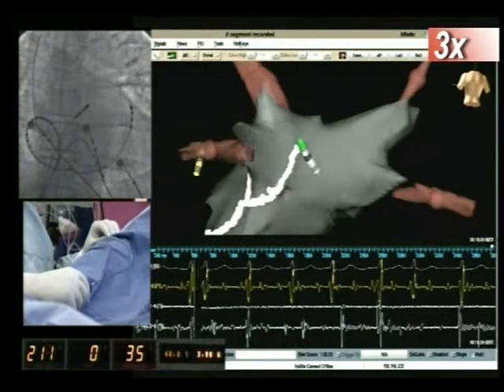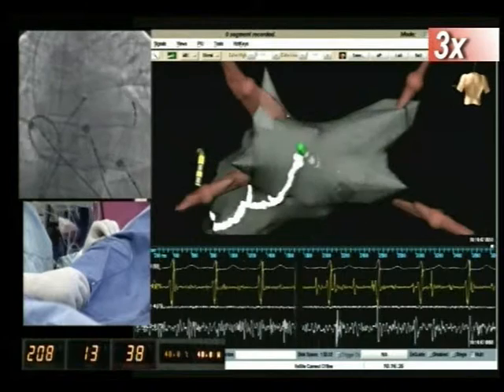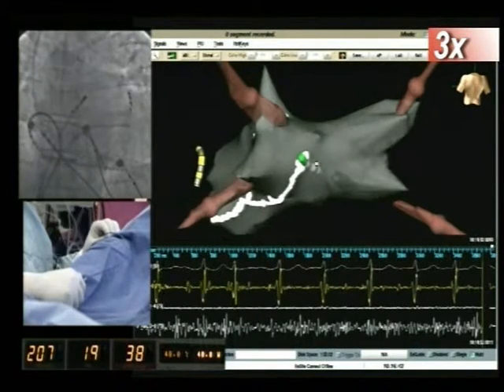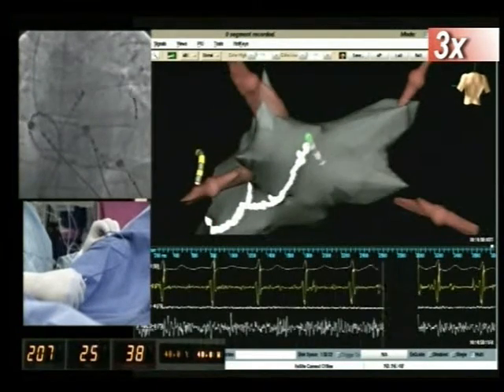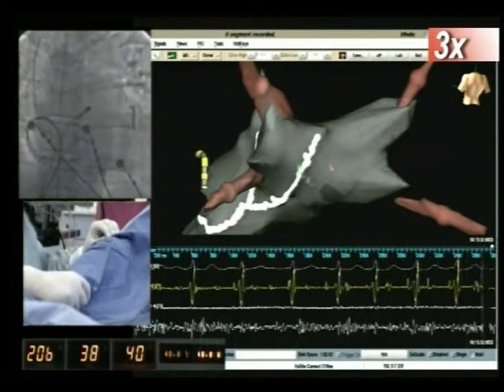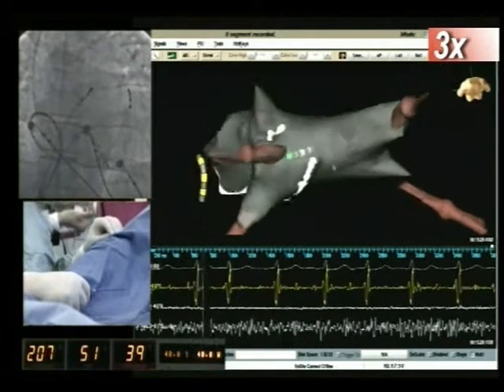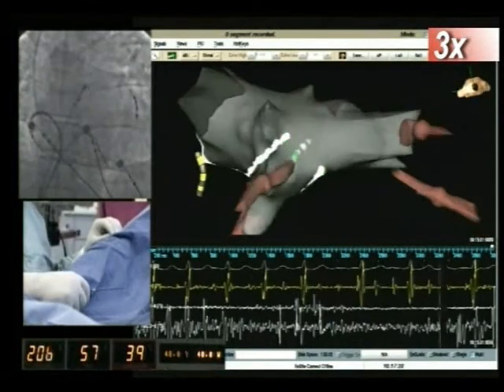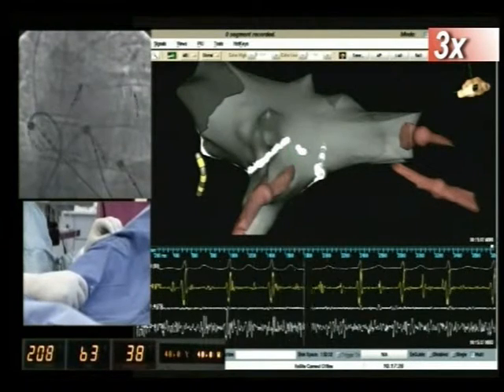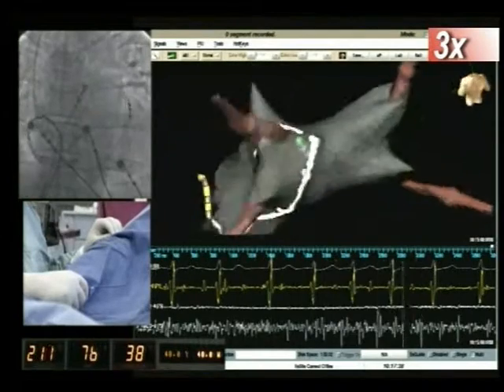In the posterior region of the atrium, we prefer to deliver repeated radiofrequency applications of short duration instead of a single radiofrequency application of a duration greater than 30 seconds, in order to avoid the risk of cardiac perforation. With the manual standard catheters, cardiac perforation may rarely occur, and atrioesophageal fistula occurred in just one patient out of more than 10,000 undergoing standard CPVA in this center.